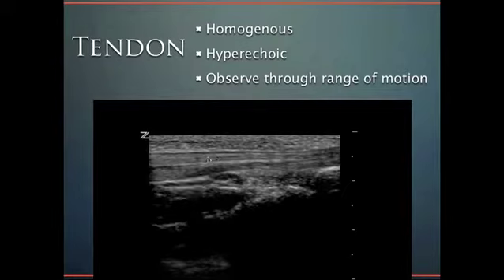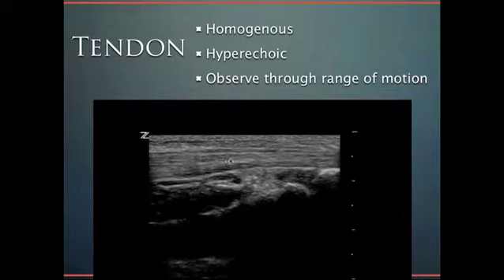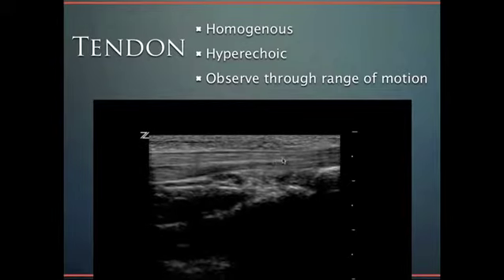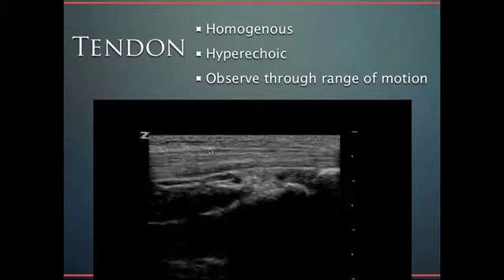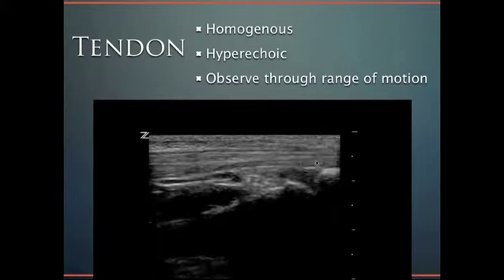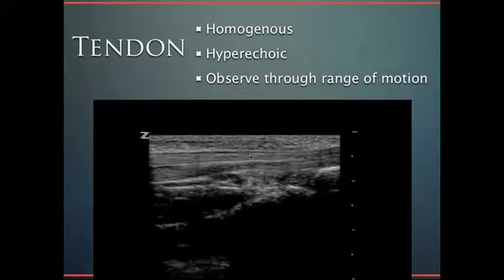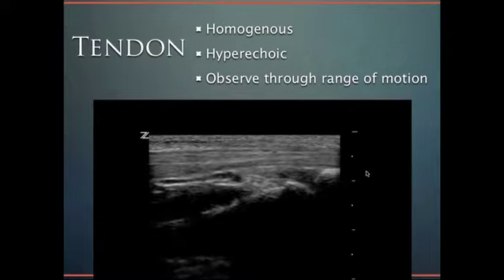Here's a tendon in its range of motion. As the joint is ranged, we can see this tendon — very homogeneous, very hyperechoic — as it moves along its tissue plane.